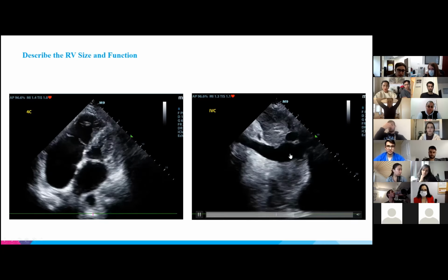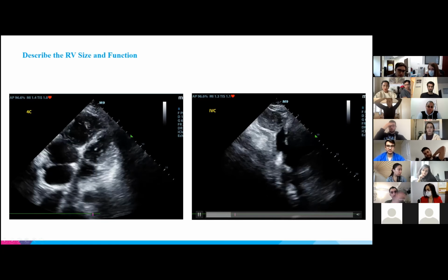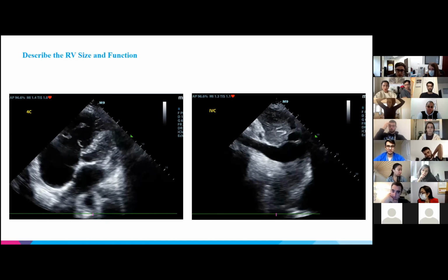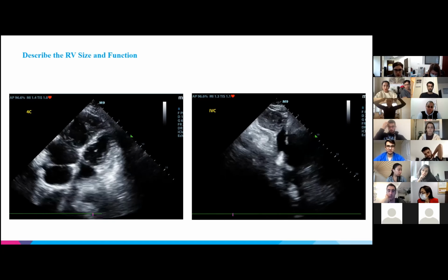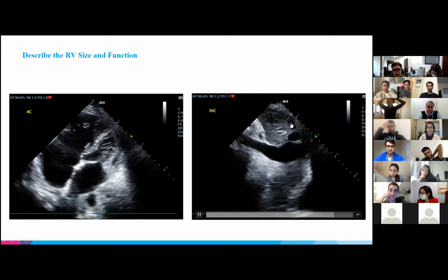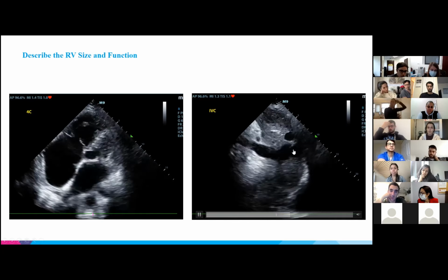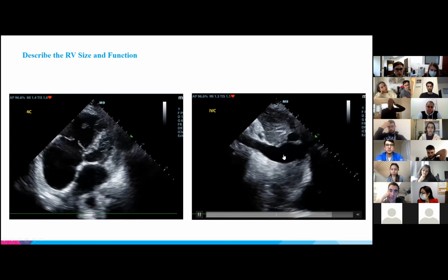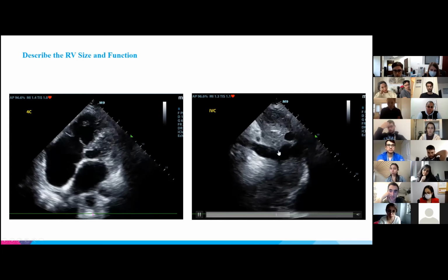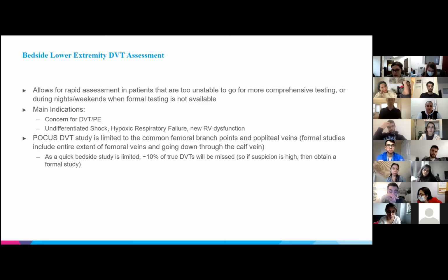And then this is the final view of her, when we took a look at her IVC. It looks very, very dilated. I think when they formally measured it on echo, it was like 3.5 centimeters. And you can even see the hepatic vein is very dilated as well. So this is someone who has definitely chronic RV overload and is very overloaded. So this is someone you might want to try to diurese, and if they are hypotensive, to even diurese while on inotropes.